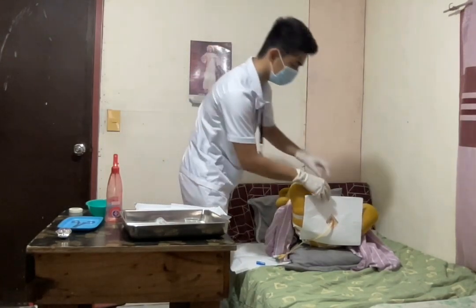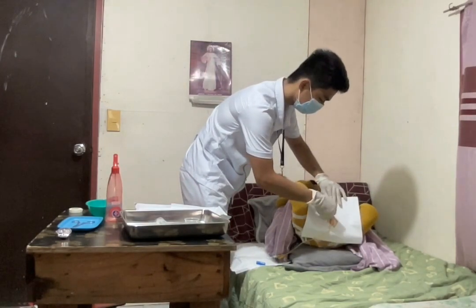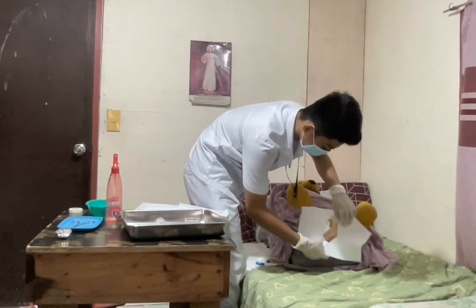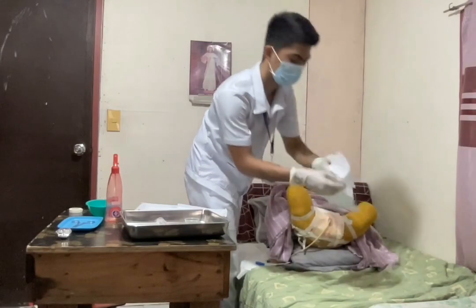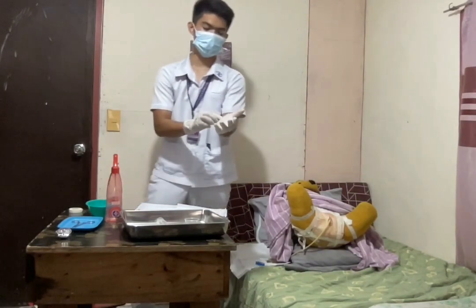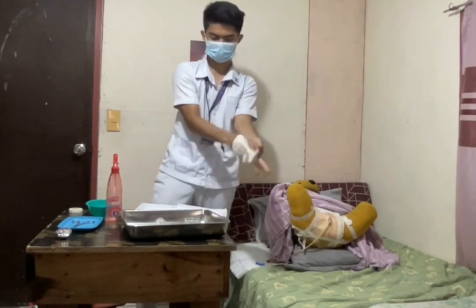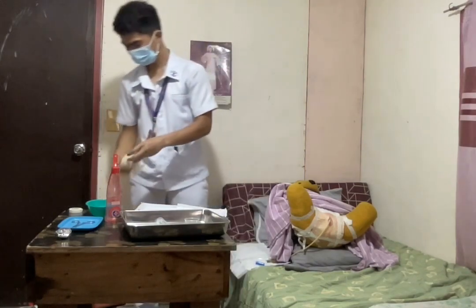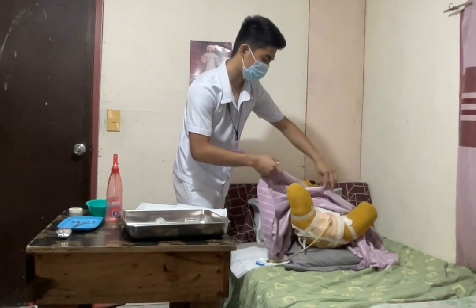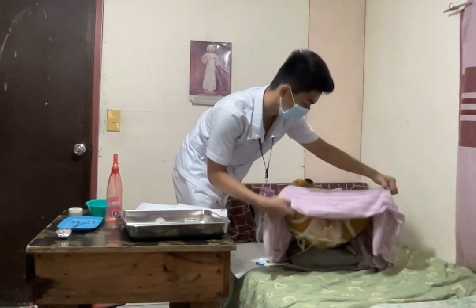I'm going to discard the eye sheet properly. Then I'm going to discard my sterile gloves. Drape the patient to ensure the comfort and privacy of her perineal area.